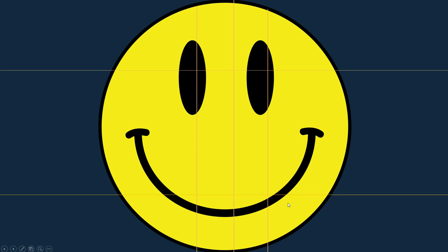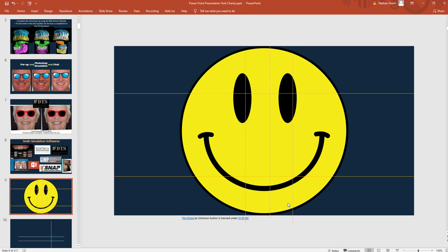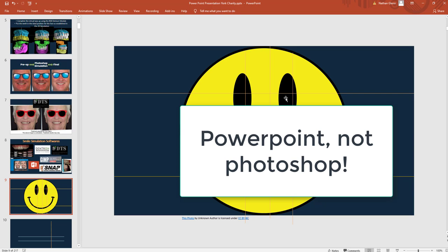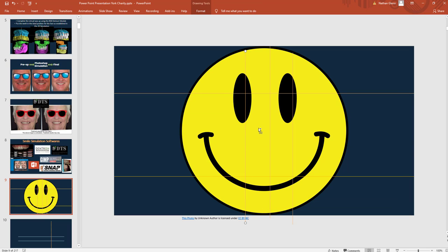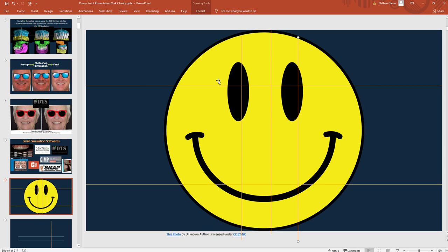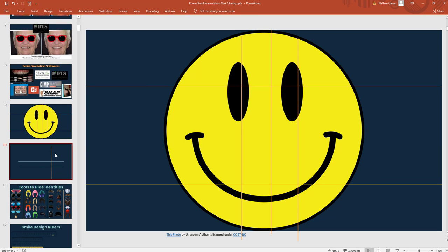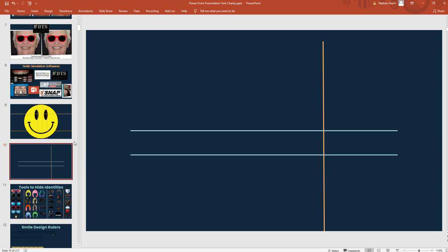Let's start with this template. This is what we'll email you — just a really basic set of lines in PowerPoint: one vertical line through the middle, duplicated to both sides, and two horizontal lines perpendicular to those. For a full-face photo, these help you line everything up to the inter-pupillary line and the midline of the face. For a lateral view, these help gauge how far forward or back you need to bring the incisal edge and align the occlusal plane to the ala-tragus line.